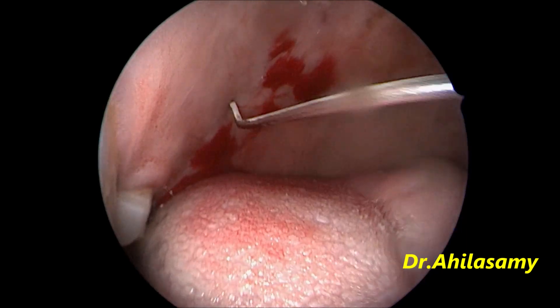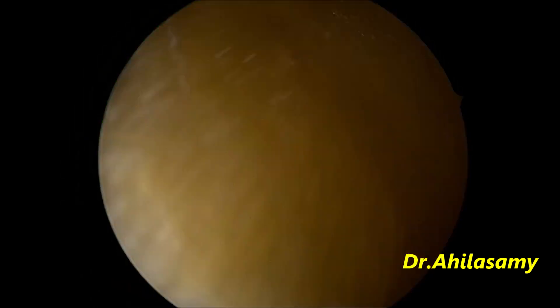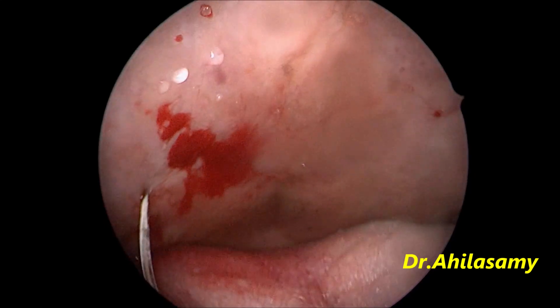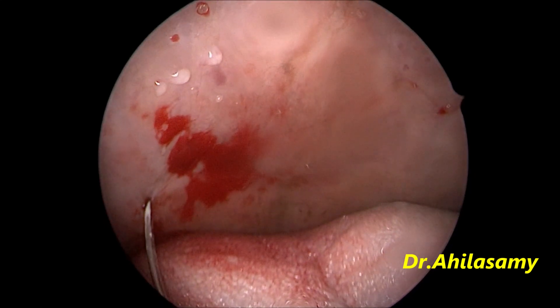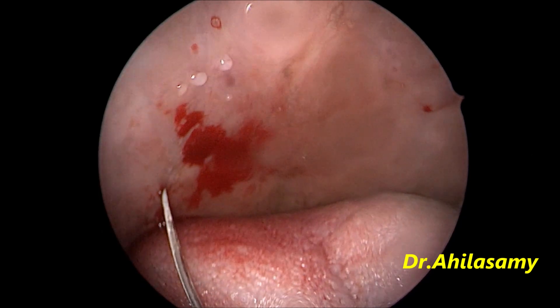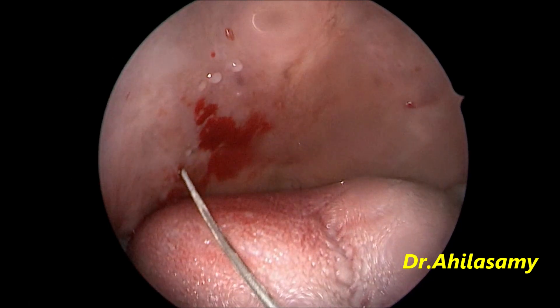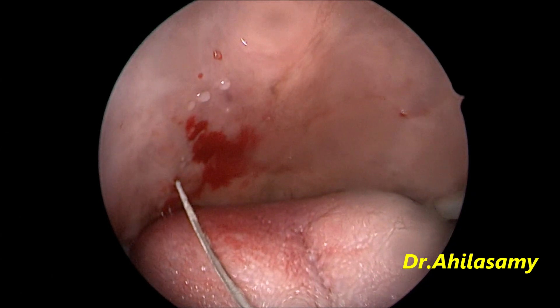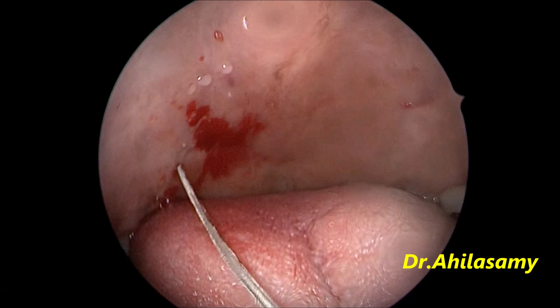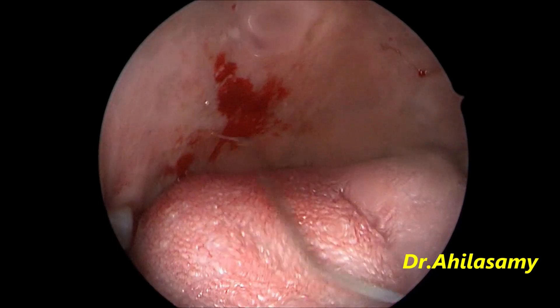This time I could feel it — see, the needle goes in very well. The whole bent area has gone in and I am gently infiltrating around 1 ml of the solution, that is bupivacaine and adrenaline — 0.5% bupivacaine. Always aspirate and infiltrate. If it is in a blood vessel, blood will come; if air comes, it is in the nasopharynx. If it is in the right plane, it will be very tough to inject and it will take some time to infiltrate. Now I am withdrawing the needle — see, the whole length of the needle is coming out.